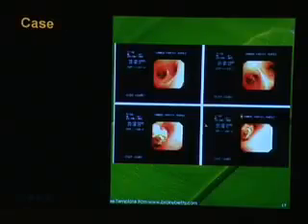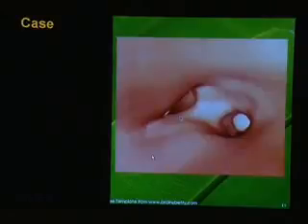And this is the fiber optic endoscopy at the attempt of laser. Then the patient had a sleeve resection, and this is the airway after the sleeve resection. They removed the bronchus with its tumor, and then sutures are taken through the upper and lower lobe, and this is a clear surgical margin. And the patient has been on follow-up for 6 years now.